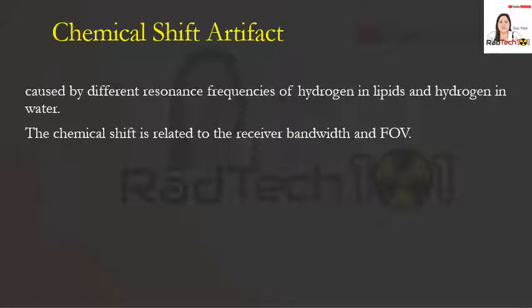So bandwidth is measured in hertz and defined as the range of frequencies involved in the transmission or reception of an electronic signal. So ito yung mga range ng frequencies na present when receiving and transmitting electronic signals. So minsan, makikita nyo kapag halimbawa nag-bog down yung isang site, na-exceed na yung kanyang limit, yung kanyang bandwidth na frequency.